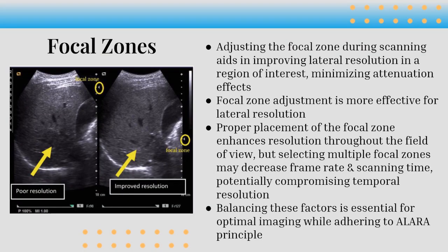So paying attention to the focal zone is a very important aspect when you're trying to optimize your images. Within the focal zone, the resolution is going to be the clearest. So adjusting the focal zone during scanning aids in improving lateral resolution in a region of interest, minimizing attenuation effects. The focal zone adjustment is more effective for lateral resolution.